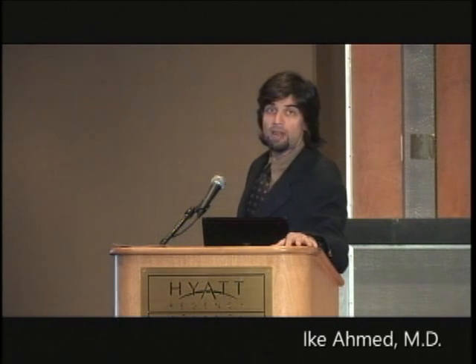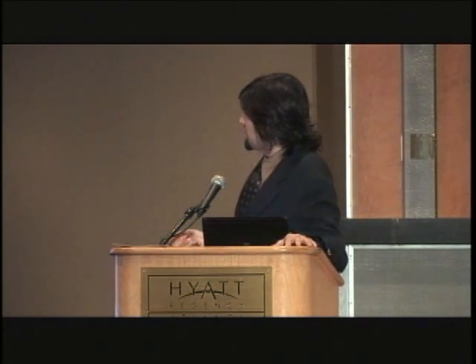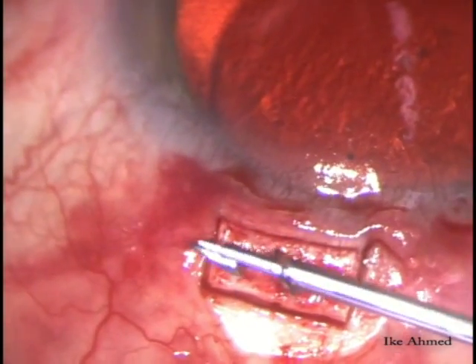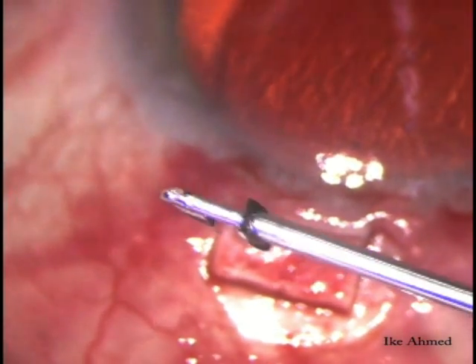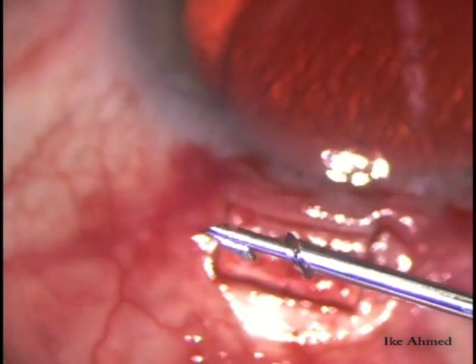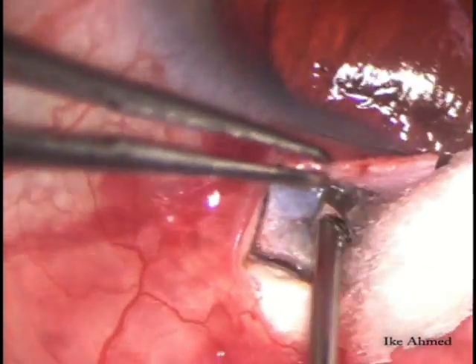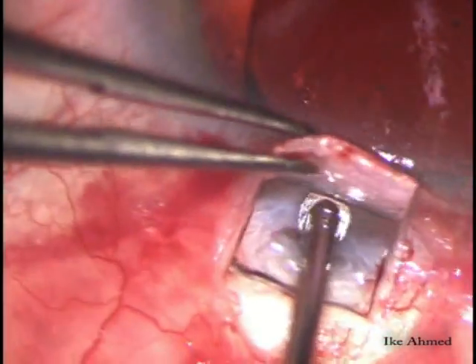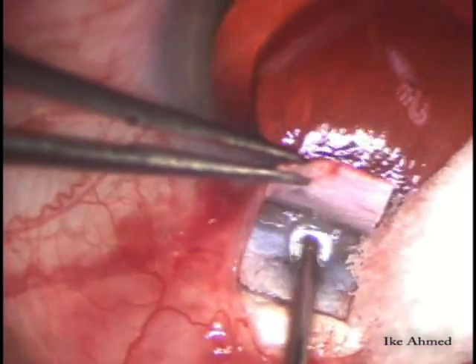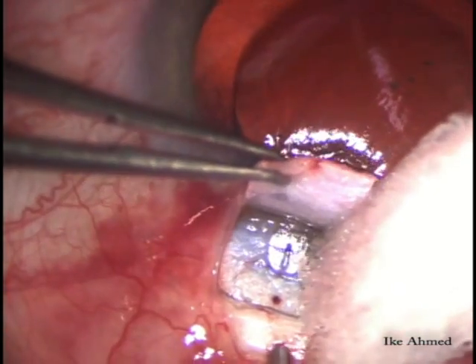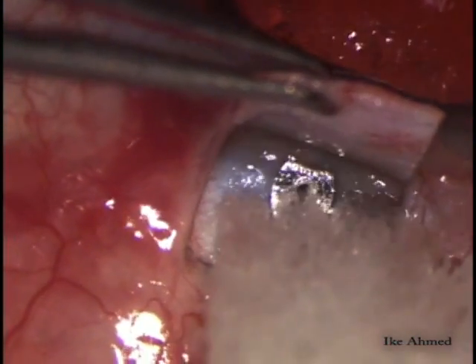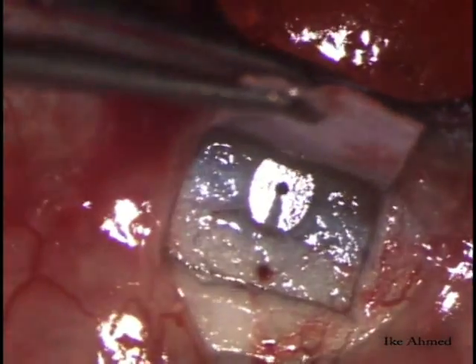Even a little bit of shallowing in riskier cases can lead to a pseudo-malignant type picture — choroidal expansion, vitreous moving forward, and shallowing of the chamber. The model shown here is the P50 model; the spur is noted here. I typically rotate the implant about 90 degrees since the implant is longer in the vertical dimension, so turning it 90 degrees is helpful. It can be a little tight — a push to get it through that opening — then releasing it, and we see the implant at the desired position.